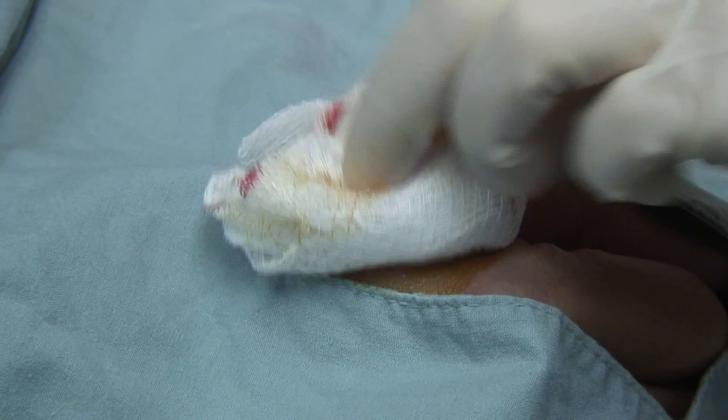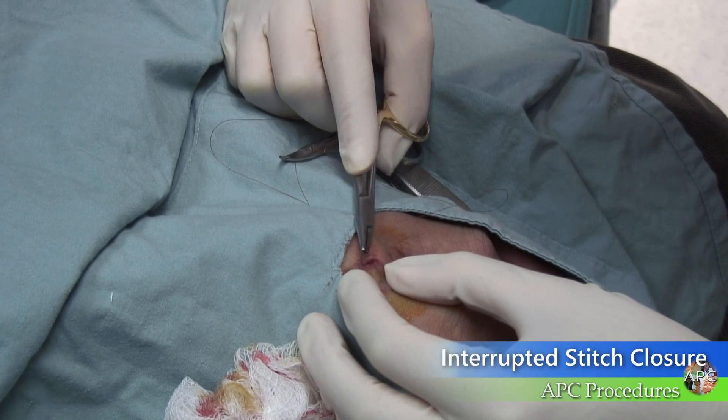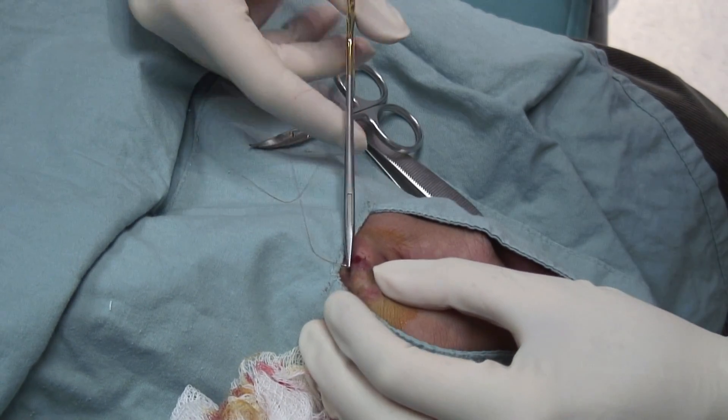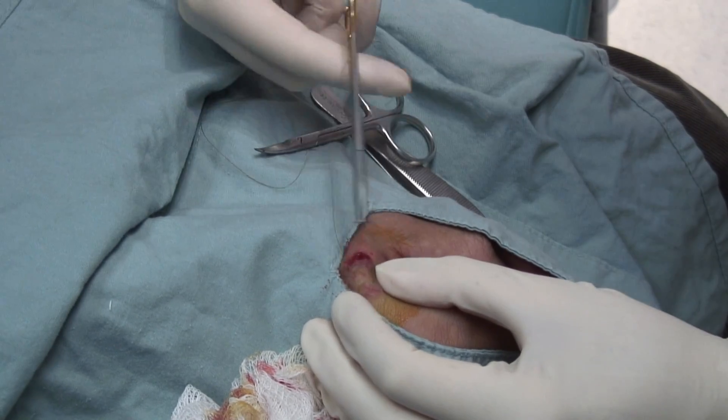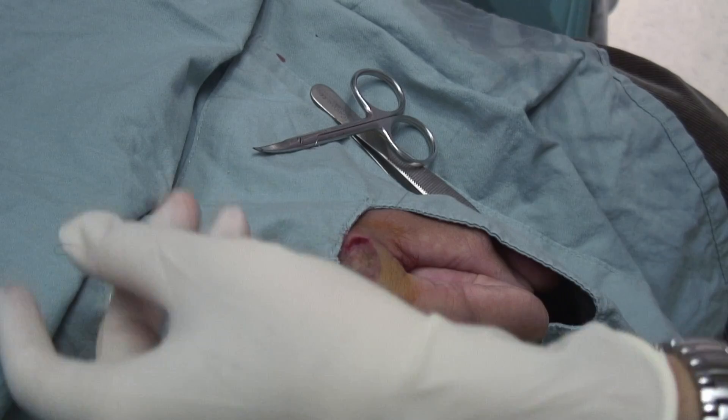Apply pressure for hemostasis. Monsel's solution, aluminum chloride, or gel foam can be used to control bleeding. Biopsies of 2 to 3 mm usually do not need to be closed with sutures, while a 4 or 5 mm biopsy will almost always need suturing.